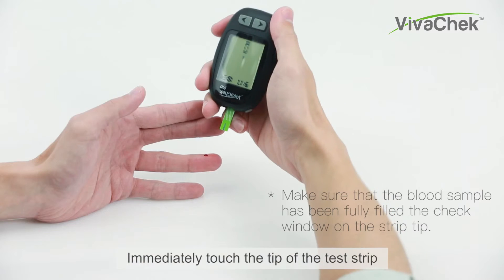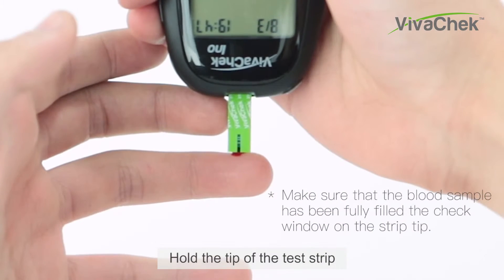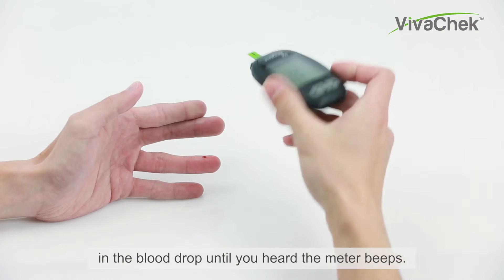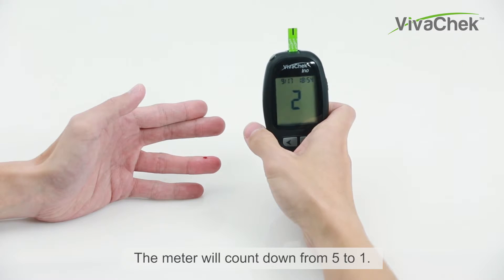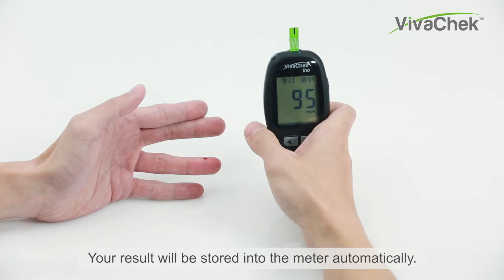Immediately touch the tip of the test strip to the drop of blood. Hold the tip of the test strip in the blood drop until you hear the meter beep. The meter will count down from 5 to 1. Now you have your test result on screen, and your result will be stored into the meter automatically.